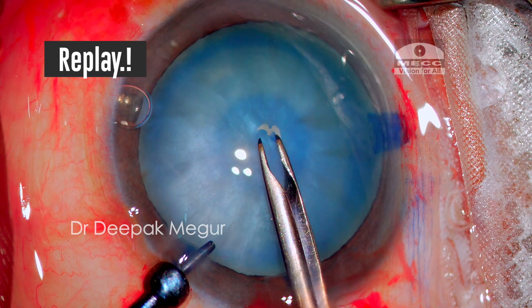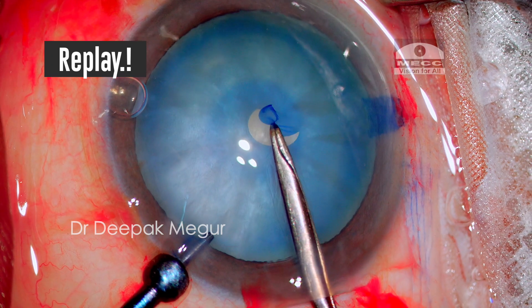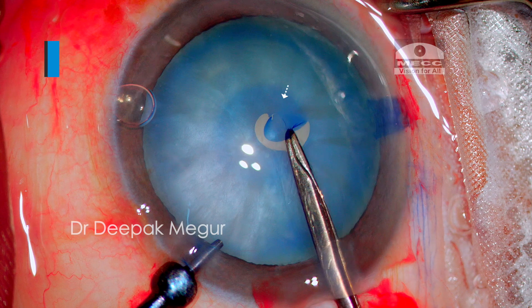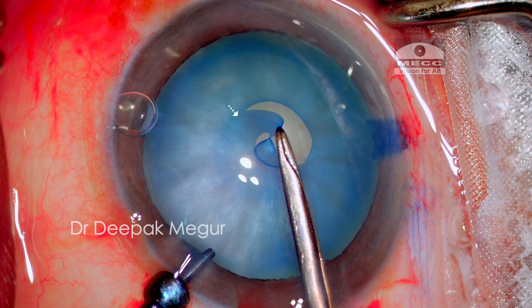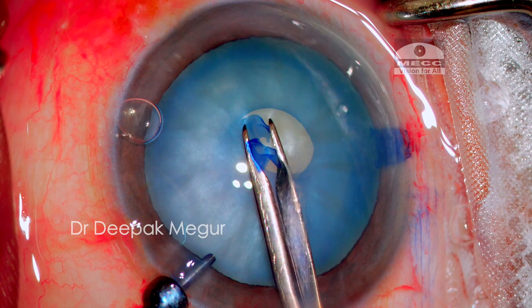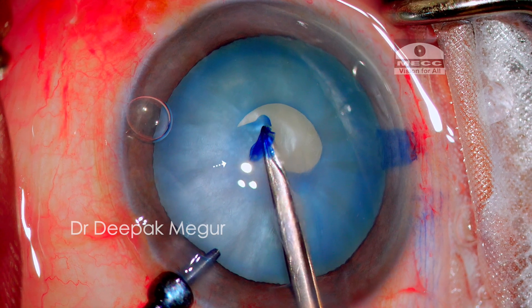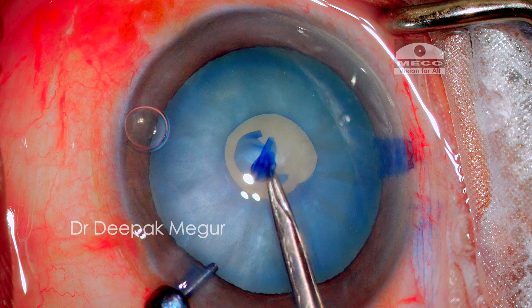Let's revisit the principles: the capsule is always kept flat, never everted or folded, and the tearing is done in short spans. We grasp it, leave it, re-grasp it, and the pull is always centripetal. Even after completion of the rhexis, it is notable that no cortex has escaped out of the bag, confirming the absence of any fluid pockets of cortex as I was suspecting.